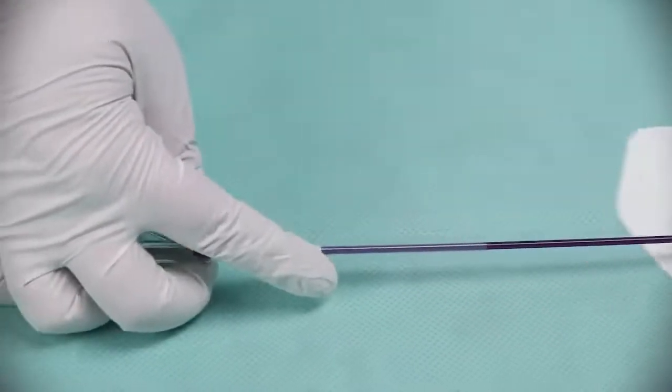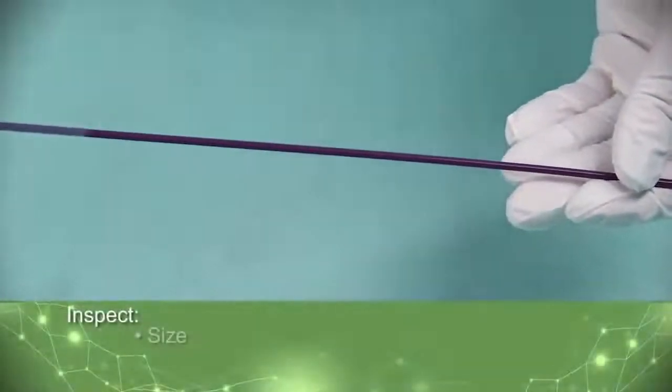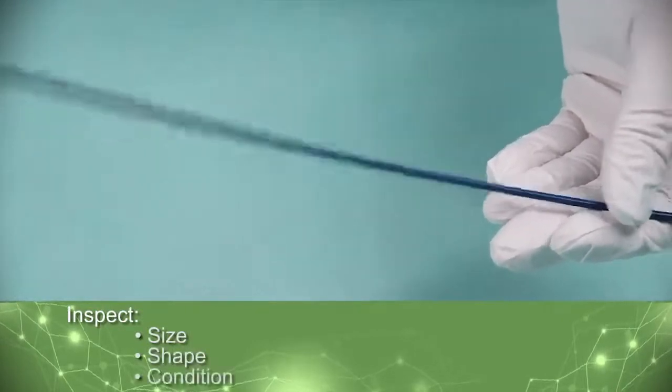Gently remove the Balloon Guide catheter from the pouch and inspect to verify that its size, shape, and condition are suitable for the patient and planned procedure.